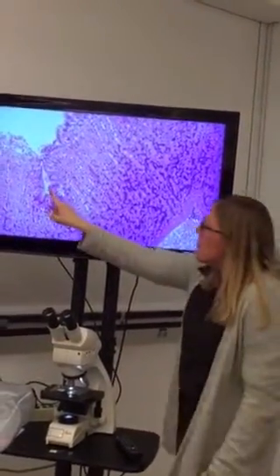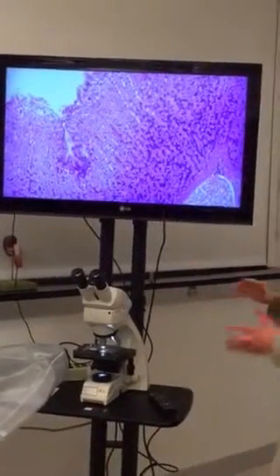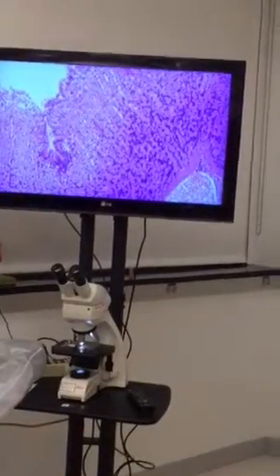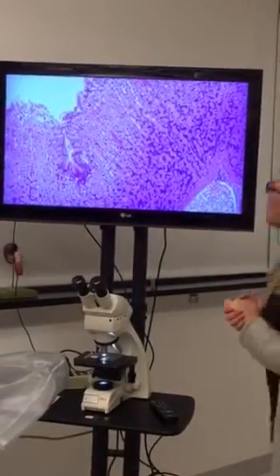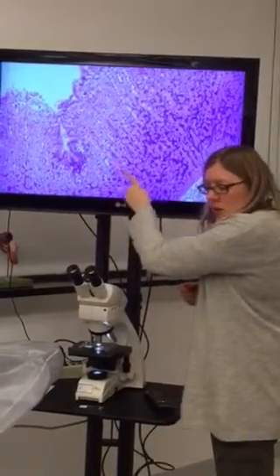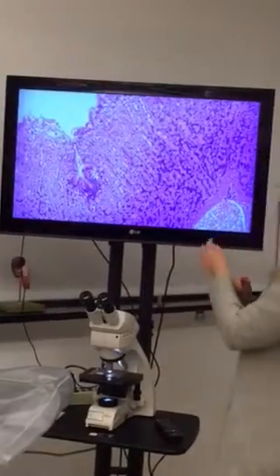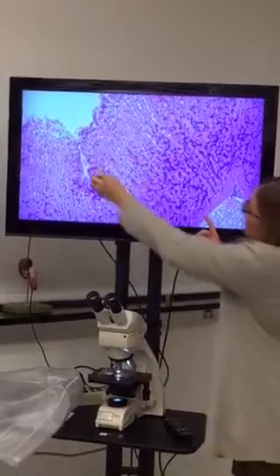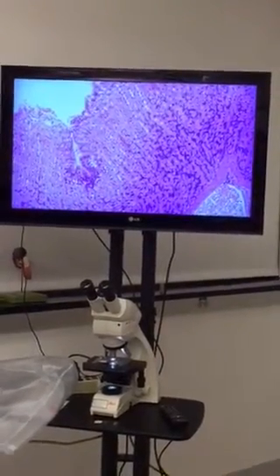Okay, let's start again. Simple columnar cells line where the food is. They have some goblet cells stuck in between them, releasing mucus. That binds the food and also protects the stomach lining from acid. We'll talk more about that when we get to lecture next week. Where all of the little simple cuboidal cells are lining the gastric pits, or little gastric glands. Okay. That's all lamina propria. So between the thin layer of muscle, the muscularis mucosae, and the simple columnar, all that is lamina propria, which includes the pits and the glands.